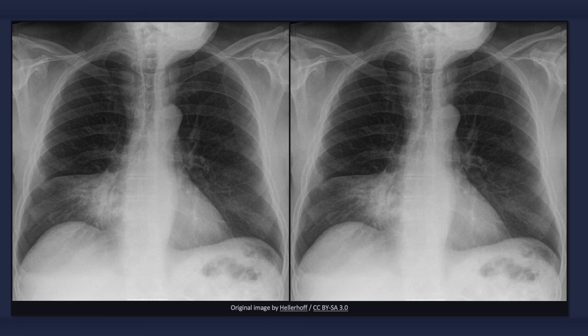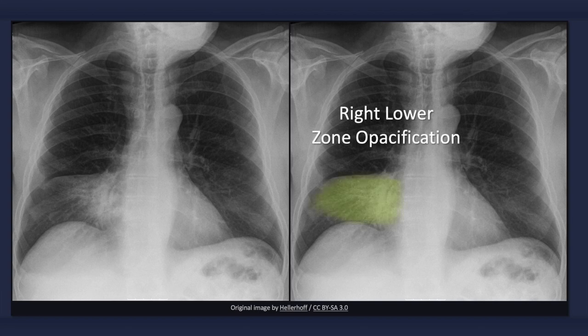When presented with an X-ray of a patient with right middle lobe pneumonia, the first finding that you may notice is an area of consolidation. The presence of fluid density material within the right middle lobe results in a wedge-shaped opacity in the right lower zone adjacent to the heart.